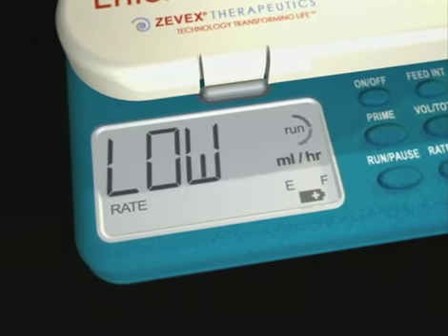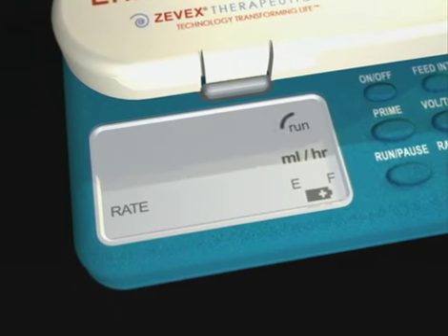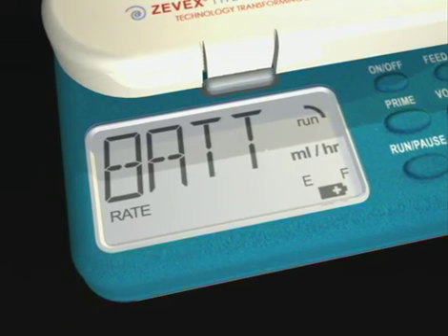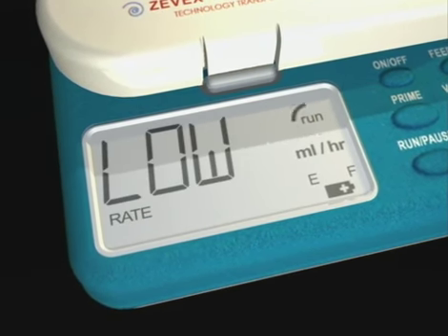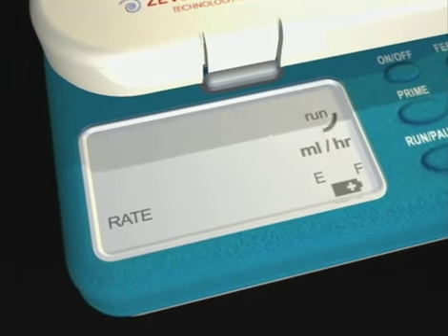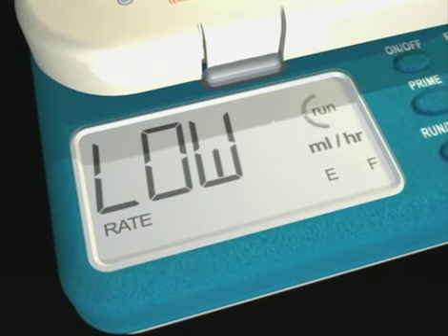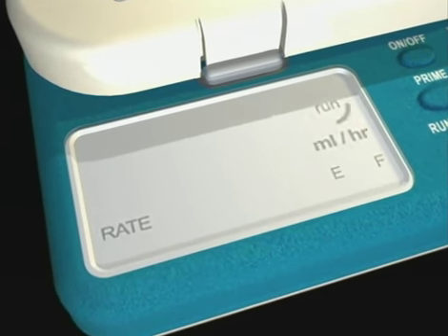When all the bars are gone, the battery symbol will blink and there will be about 1 hour of charge left. To remind you of the low battery condition, the pump will beep every 2 seconds and the abbreviation low bat will flash in the display. The pump will turn off automatically when the battery is completely depleted.